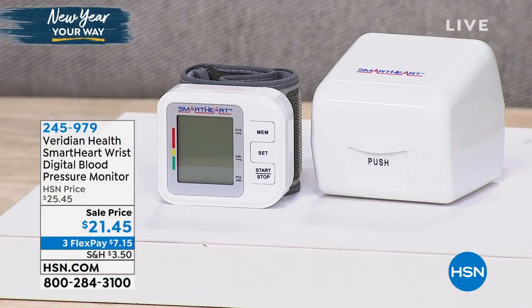You get more proactive, and every time you go to the doctor, you're a better patient as well. This is one of those items. This is from Viridian Health. It's a smart heart wrist digital blood pressure monitor.